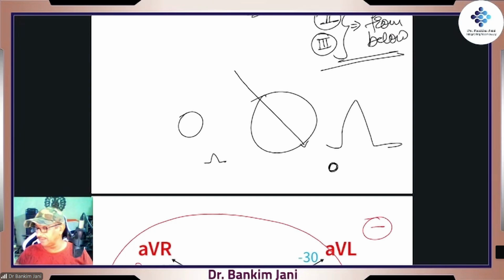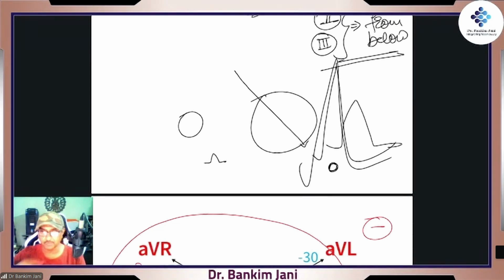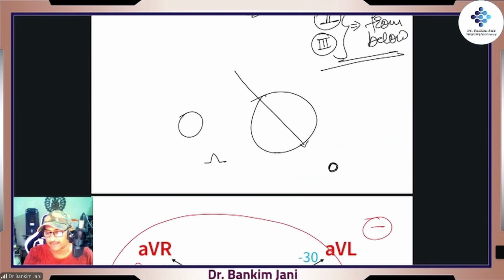In the case of cardiac enlargement, like left ventricular hypertrophy, the left ventricle as such is a big muscle. When there is hypertrophy, the muscle becomes big. Yes, you will be watching ECGs like this, with big spikes. So that's the thing, quite easy.